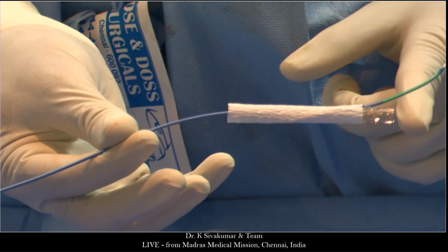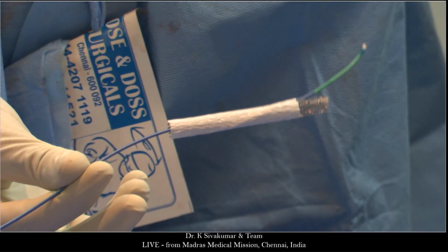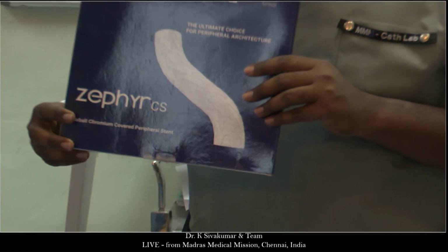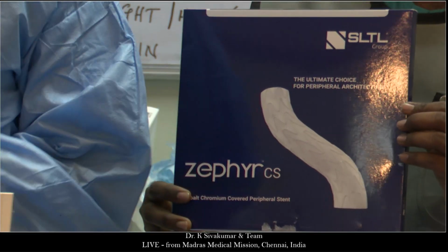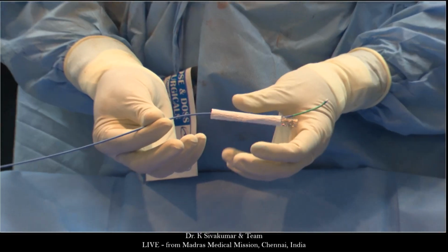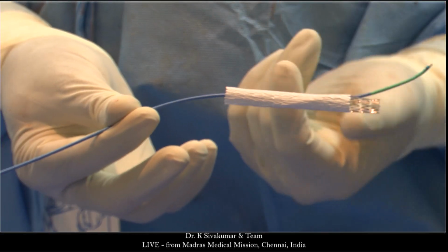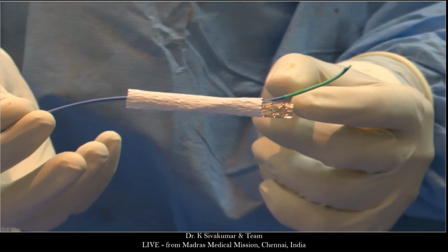Make the photo bigger. So this is a stent which has got two components. The last 15 millimeter, this stent is made by Zephyr. Turn around. So this stent is Zephyr. This is an Indian made stent. It's a cobalt chromium stent. Come back here. So this stent has got an 8 centimeter length. 65 millimeter is covered, 15 millimeter is uncovered.